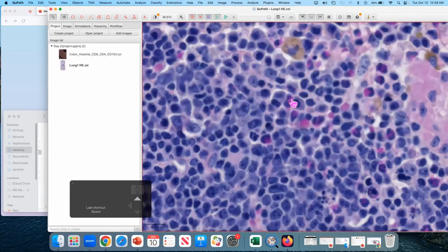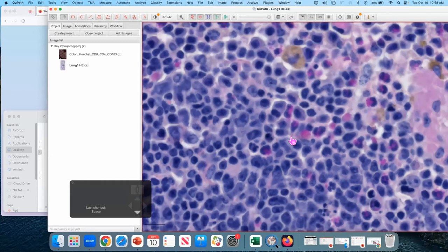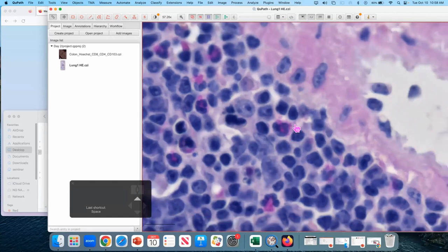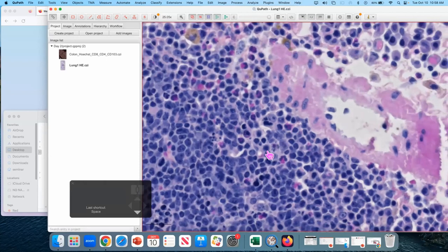You see these cells with bilobed nuclei, and they also have this bright eosinophilic cytoplasm. Here you can make out the granular nature of what's pink. It's not just a solid pink, but basically you have a coalescence of these granular things. So that makes these eosinophils.